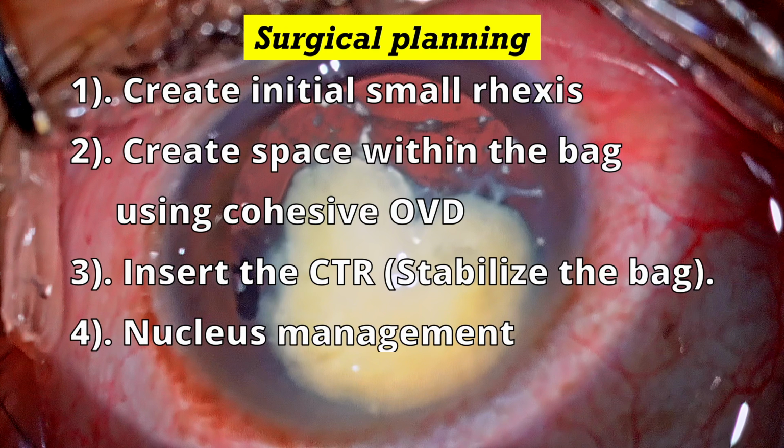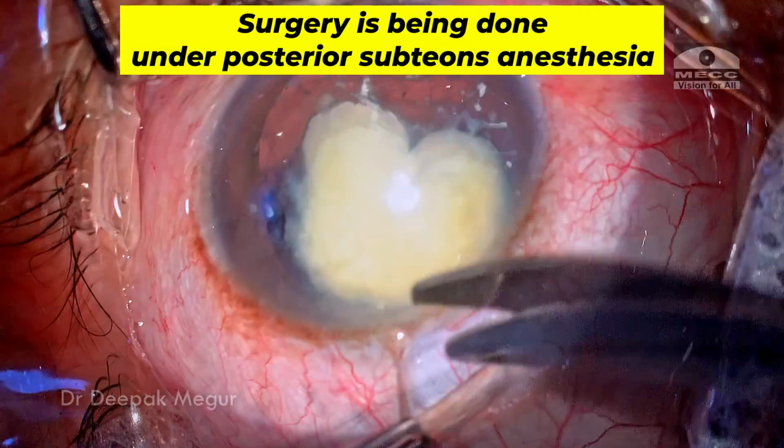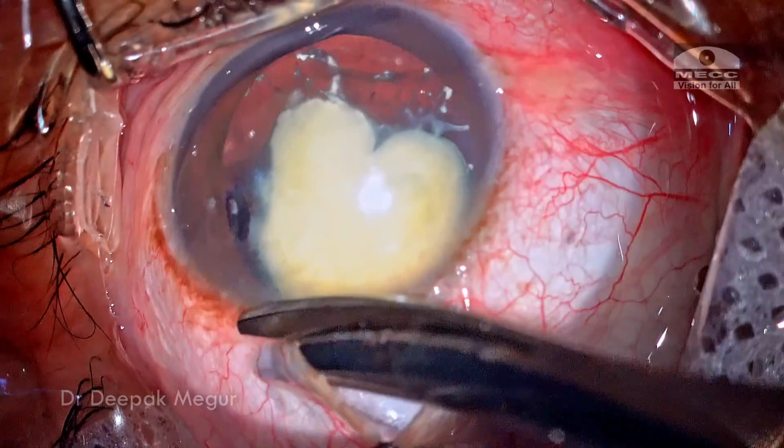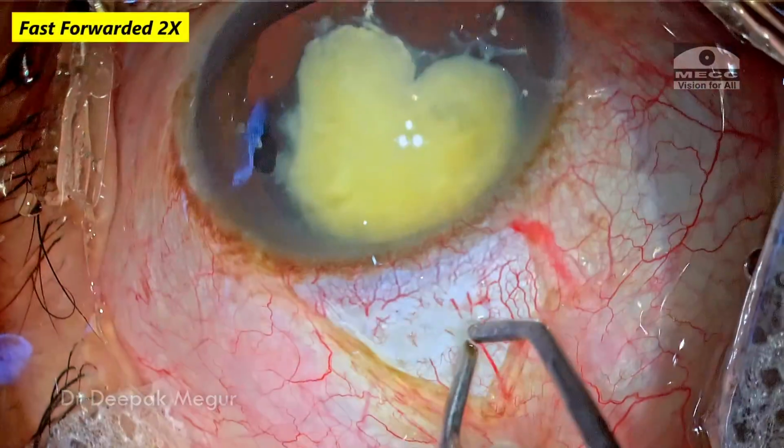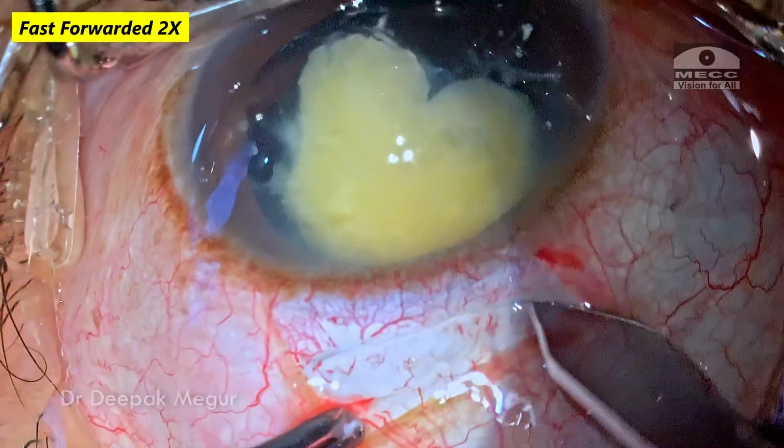My plan for managing the nucleus is to remove it manually. I don't want to go in with phacoemulsification in this case. So that is my plan, and let's see how things turn out. The surgery is being done under a posterior subtenon anesthesia. The conjunctival flap is raised, the bleeding episcleral vessels are cauterized, and I begin my scleral tunnel.